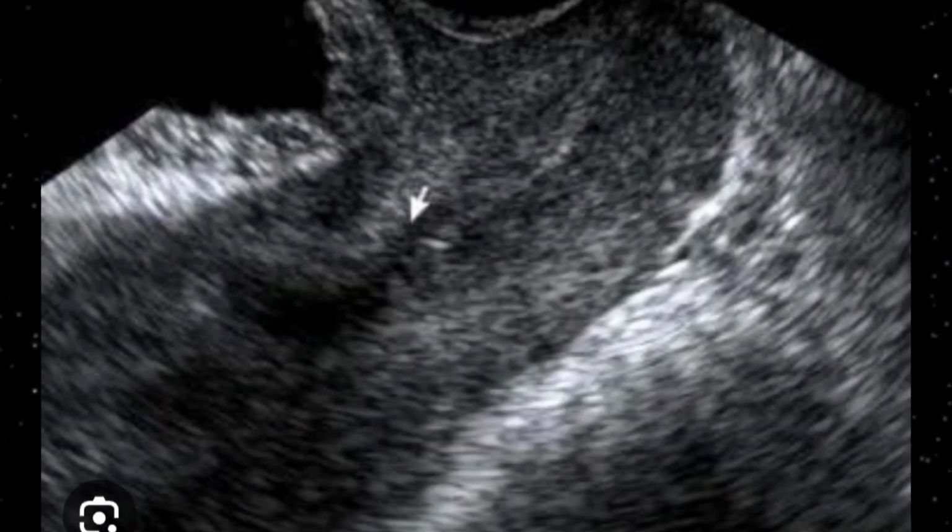On the upper part, no fetal parts can be seen, because you can see this small membrane which is going down towards the internal os. It means this is the stage when the membrane starts bulging into the internal os.